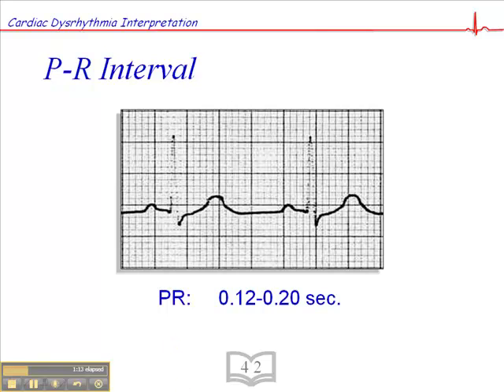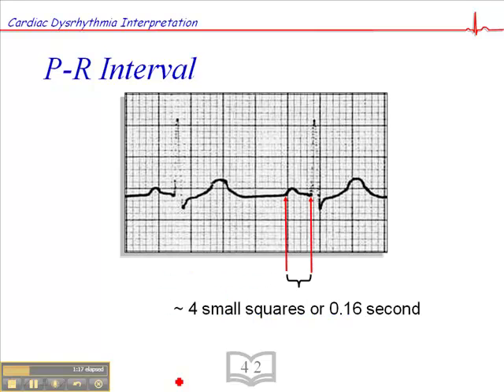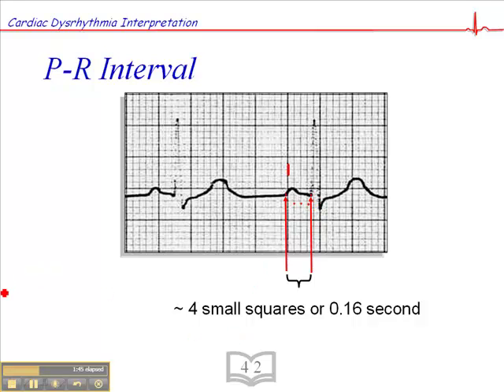That's three small squares to five small squares. To measure the PR interval, we look at the very beginning of the P wave to the very beginning of the QRS complex. It's easiest to look for a P wave that begins on a dark line, then count out the number of small squares between the onset of the P wave and the onset of the QRS. In this case it's four small squares, which is 0.16 second.